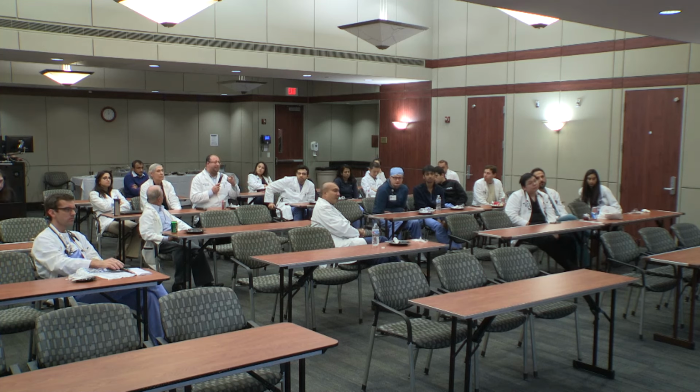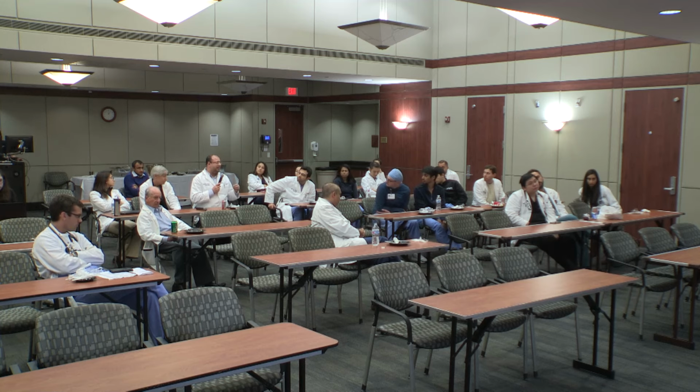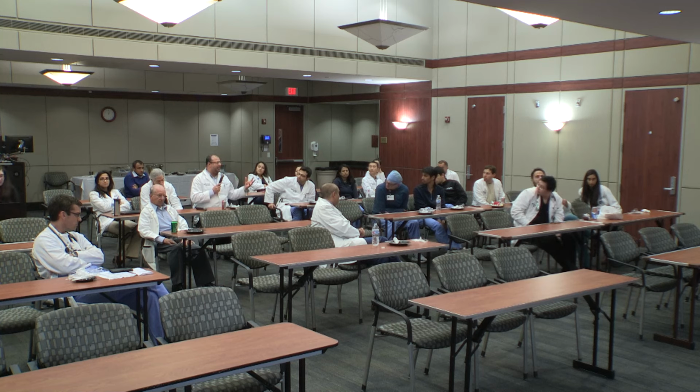The committee that came up with these guidelines sat down and did the pretest likelihood. Because now we're testing so many low-risk patients. So if you take everybody coming to our non-invasive lab, the chance of having a normal study is very high. It's as high as 90% in some labs.